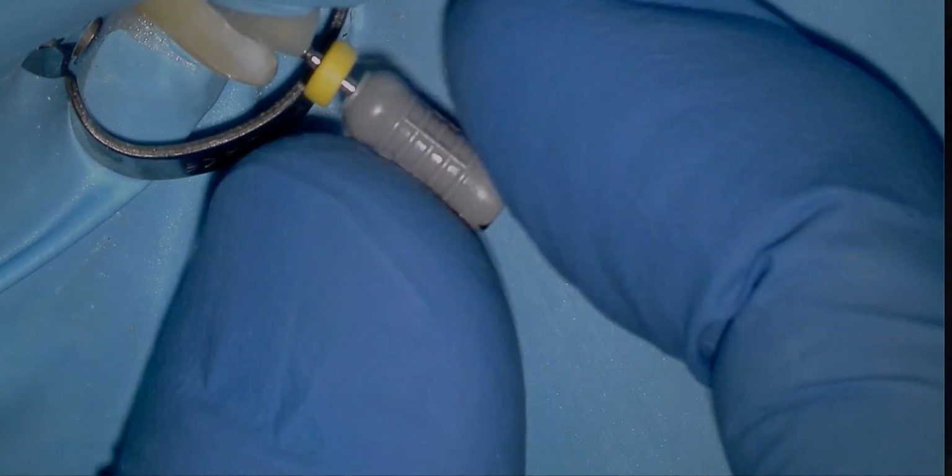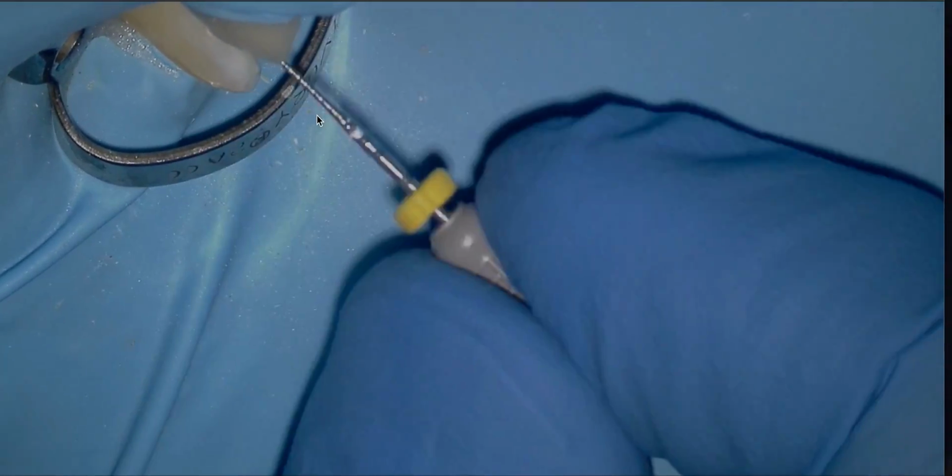So what we're going to do is 3 to 4 rounds of that little biting with a 6 file. Then we're going to go to an 8 file. And what I want you to watch is not so much where the stopper is, because it's kind of random right now. I don't place it. I mean, I guess I could. Really look at where the shank of the file meets the handle in terms of depth.